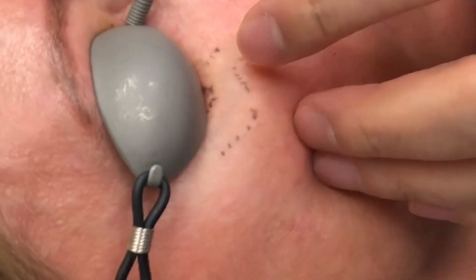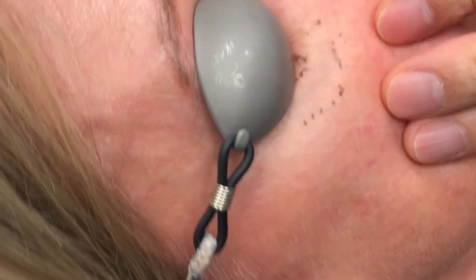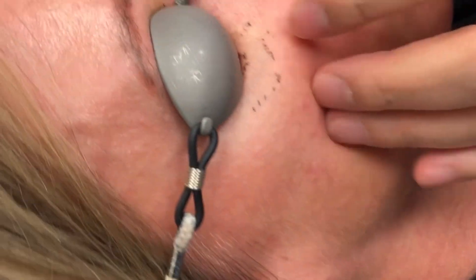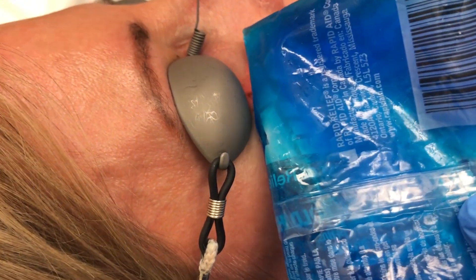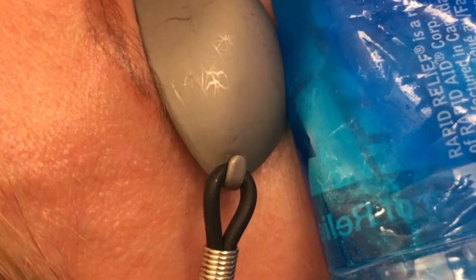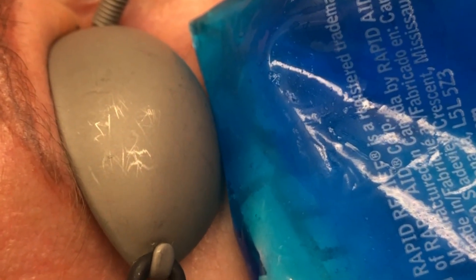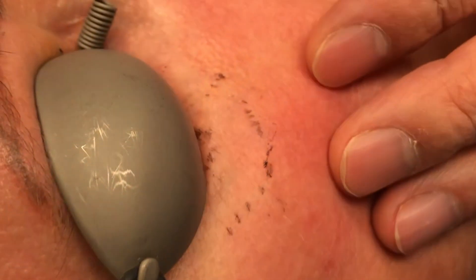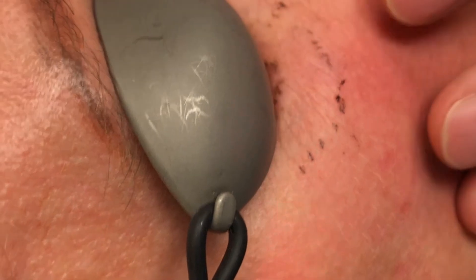So what we're going to do is laser out some of the dilated veins around the eye — you can see right there — we're going to try to get rid of that. First a little chilling, just to chill, maybe a little more towards the eye shape. And then a little bit here, we're going to zap it. It's going to feel like a little pulse. So you can see how it's already gone from there — that spot is already gone.